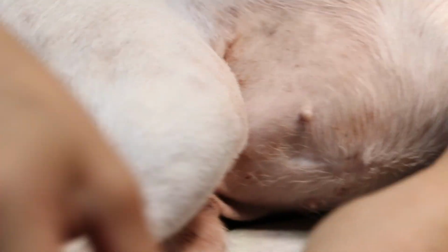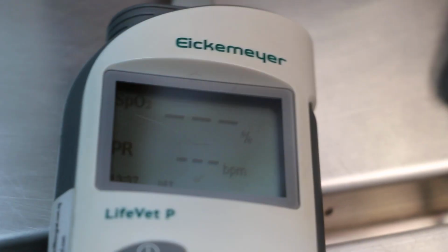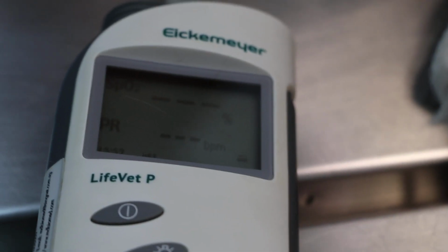So we have this oximeter on, and then we'll check the pulse. We'll try to do as fast as possible so that the dangers of anesthesia should be minimized.